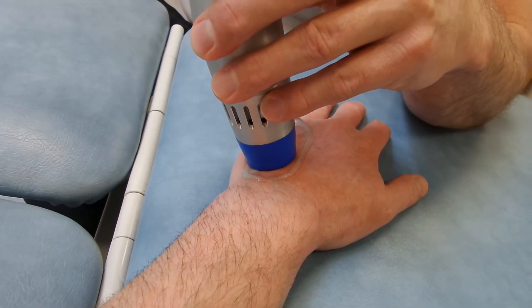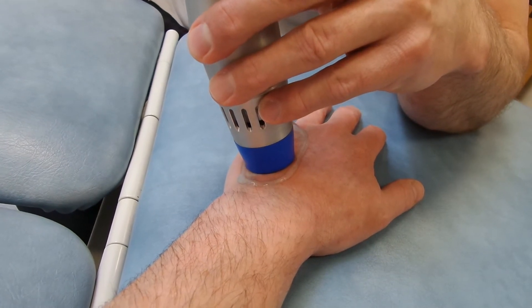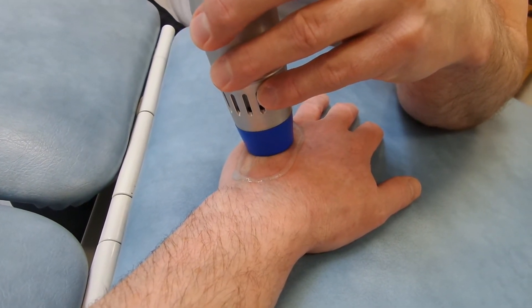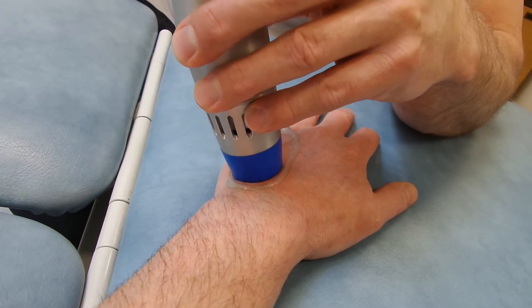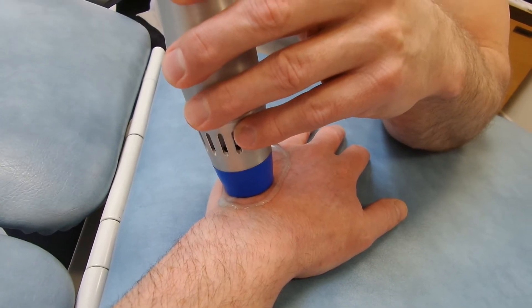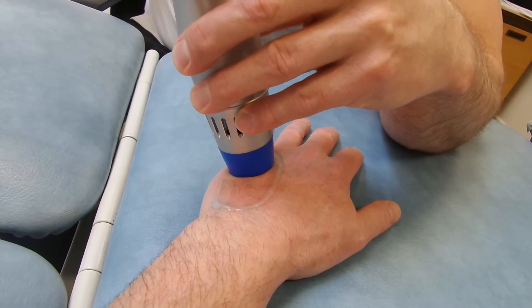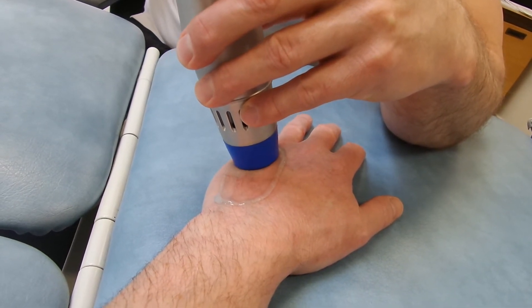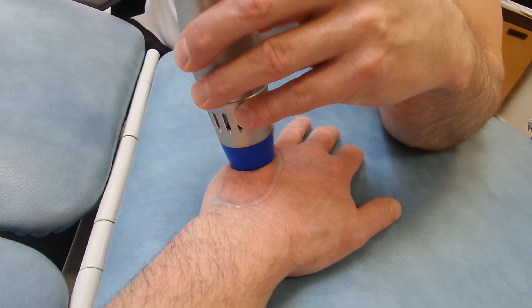But I know that's the last bit of the injury. That's definitely a deeper tone there. It's so consistent with these electromagnetic machines — just straight on to it. And a bit there as well. Yeah, a little bit left there, just down there.